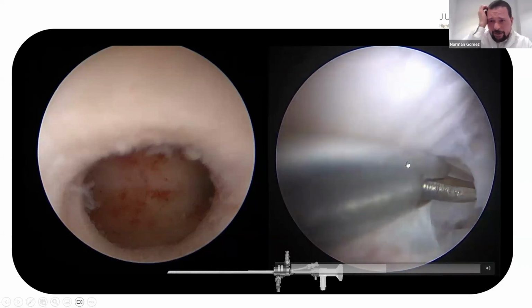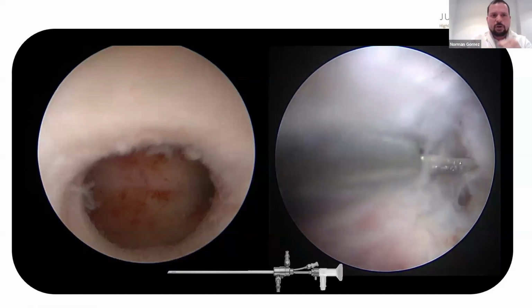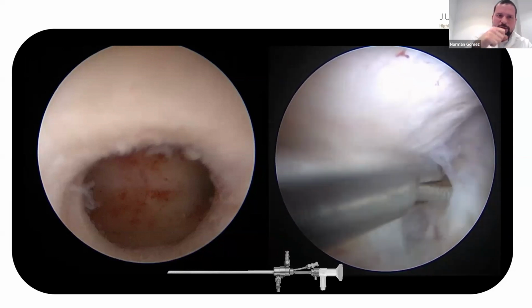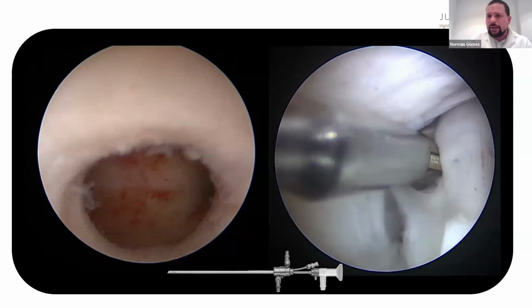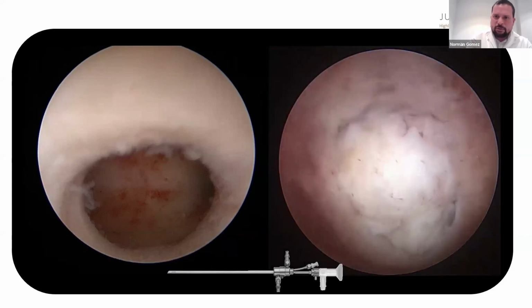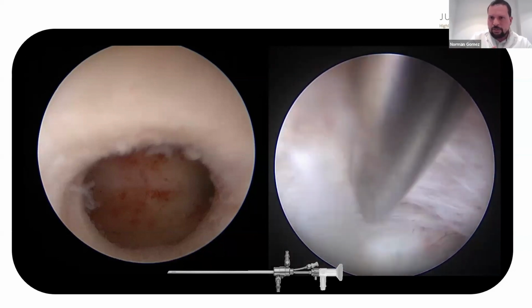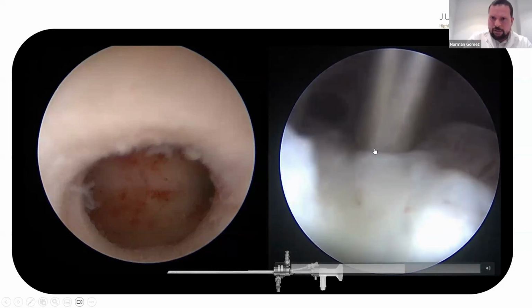So this is a very dynamic surgery because you need to rotate the hysteroscope at some points during the surgery, and rotate the scissors. In some ways it's complicated to do that, but with experience you gain a lot of training with the movement of the hysteroscope, and you can perform this kind of surgery.